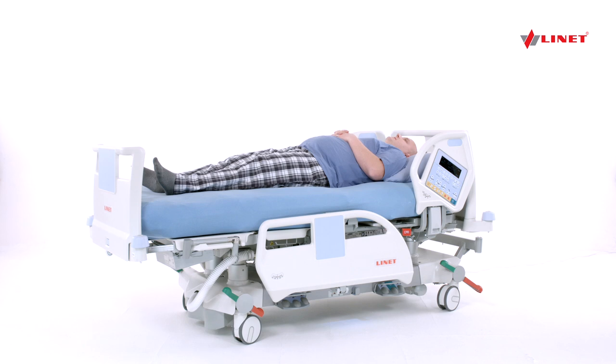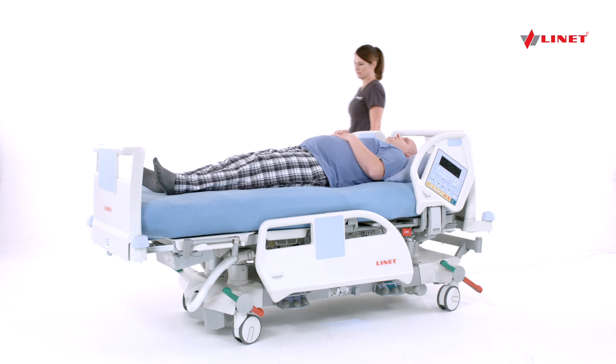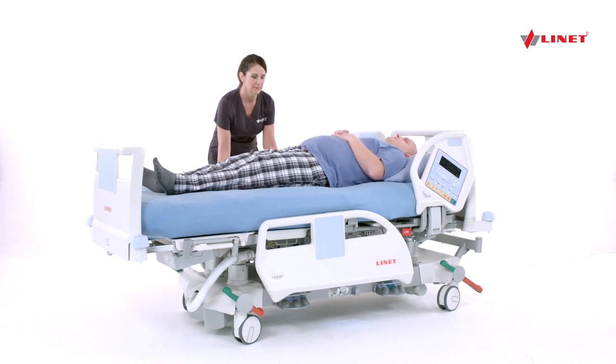Lateral Turn Assist is an assist to turning. This feature is designed to prevent caregiver injury, create a more gentle turn for the patient, and assist in pressure injury prevention programs through improved ease of repositioning patients.